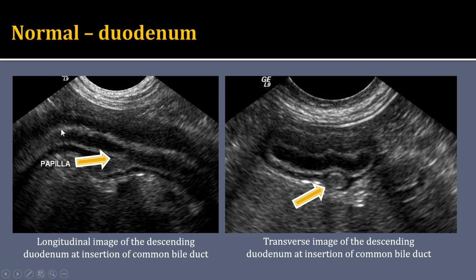This longitudinal image here shows us our normal wall layering and proportion on either side of an empty lumen. And then here's the common bile duct, pancreatic duct combination actually coming into the papilla. These are a little bit more echogenic, and if we sometimes see the papilla actually traversing the mucosa, it will also look more hyperechoic to the hypoechoic mucosa.